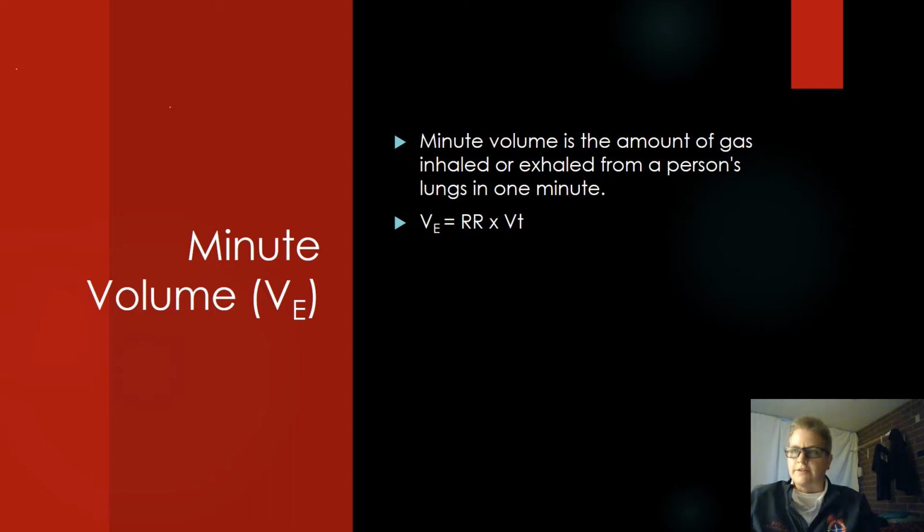Do our circuits cause dead space? We understand from before our dead space from our trachea, our bronchi, and all that sort of stuff. Well, our ventilator circuits create dead space. Our ET tubes create dead space. The end-tidal CO2 devices that we put in between our bag valve mask and our ET tubes, that is more dead space. So we'll look at that in a later section, but it is pretty important.